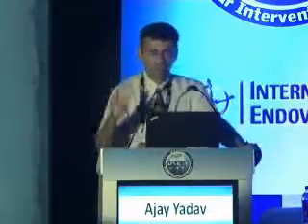Different devices use different parameters for sizing. Gore uses the inner wall, Medtronic does an inner wall with Endurant, and of course, Cook, the outer wall. So the exact measurement, the shortest diameter, the longest length, then the calcifications, all these little things make a difference when you're doing a successful case. If any calcification is noted in the chart, keep that chart right in front of you when you're doing it. And whenever you're tracking the device or removing the sheath, make sure you're focusing on that particular area. Almost all devices, especially the hydrophilic sheaths that we have nowadays, can easily be pushed in. It's always the pulling out which gives us problems.